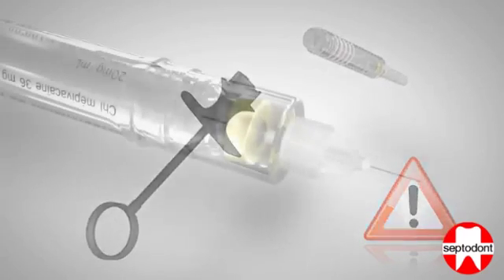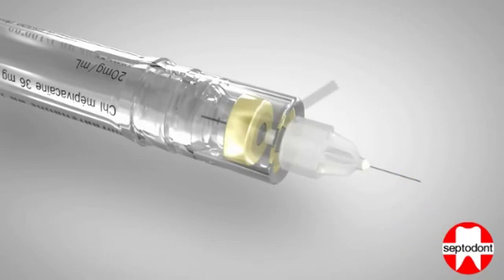during use. At the rear end of the needle cannula inside the cartridge barrel, there is a small protuberance. Throughout the injection procedure, this protuberance depresses the cartridge diaphragm, resulting in aspiration when injection pressure is released.